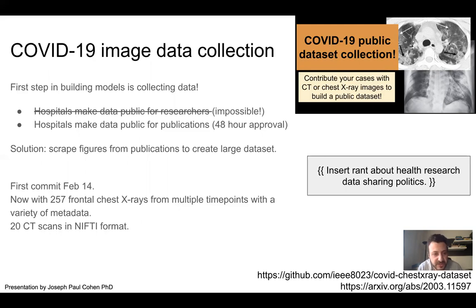We started this project on February 14th. We now have almost 257 frontal chest x-rays with various time points through the patient's course, and some severity indications, whether they survived or whether they were intubated. We also have some CT scans available as well.